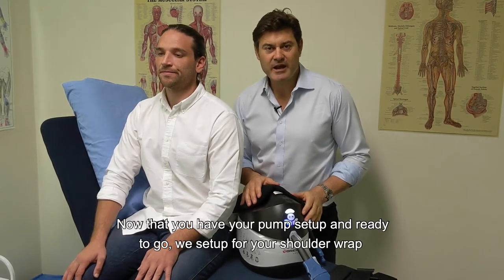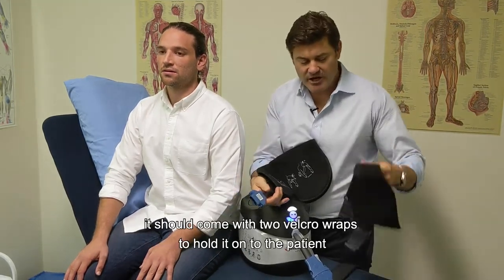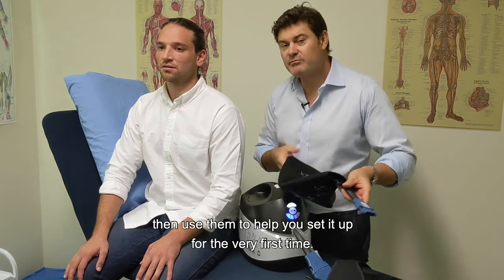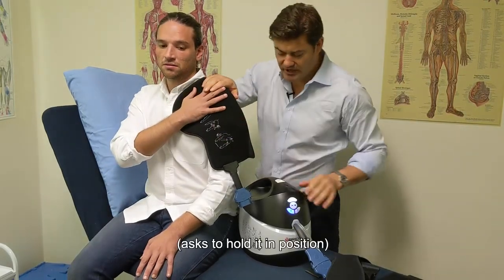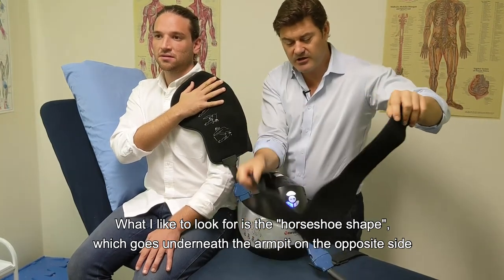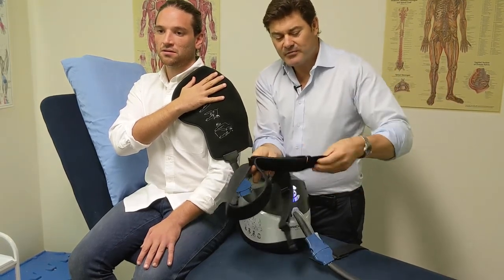Now that your pump is set up, it's time to set up the shoulder wrap. A shoulder wrap typically looks like this and comes with instructions on the wrap itself, along with two velcro straps to hold it on the patient. Make sure your patient is in a comfortable position before connecting everything. For the left shoulder, the key is making sure the velcro wraps go around the correct way — look for the horseshoe shape, which goes underneath the armpit. If the wrap is upside down, the horseshoe will face the wrong direction.